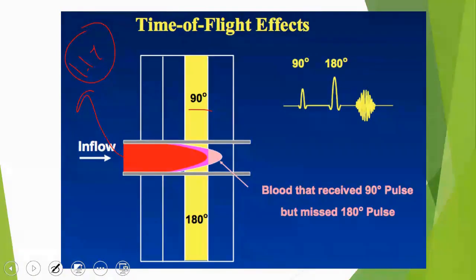There should be excitation. It has the same longitudinal relaxation we were discussing. No problems there. However, the blood itself is moving. If I have chosen a specific slice, when I apply the 180-degree pulse, should I apply it in the same slice or in a different one?